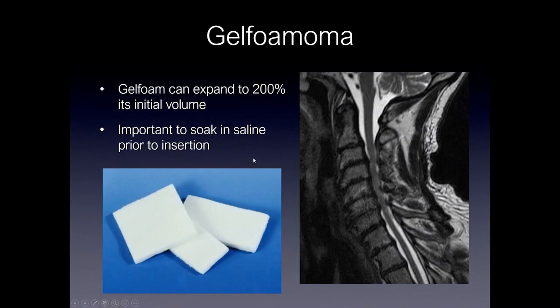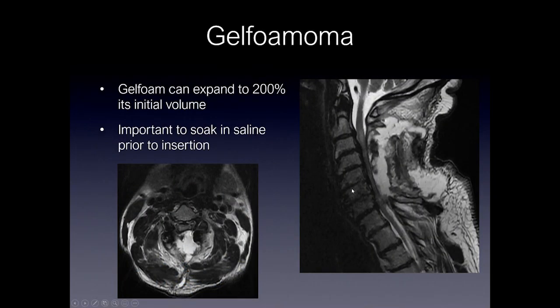Gelfoamoma is a term used for gel foam resulting in significant mass effect on the spinal canal after surgery. Gel foam is a hemostatic agent used to control bleeding, but it can expand to 200% of its initial volume. Typically, surgeons soak it in saline for several minutes prior to insertion; however, you can still get significant enlargement after placement. On the T2-weighted image, you can see a hyper-intense structure causing severe mass effect upon the spinal cord and severe canal stenosis — this turned out to be gel foam that was placed. The patient went back to the OR and it was removed. The differential also includes hematoma and postoperative fluid collection.